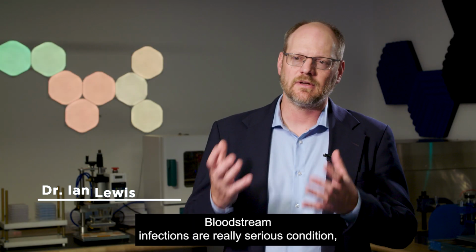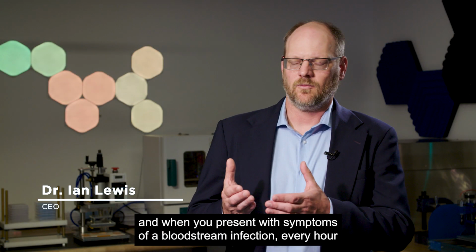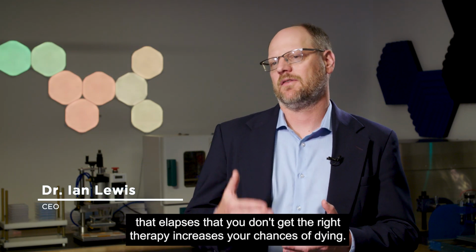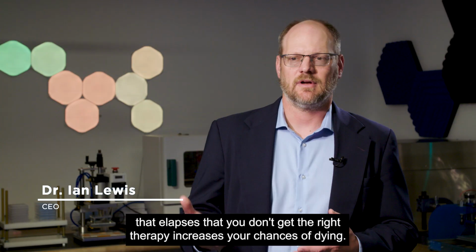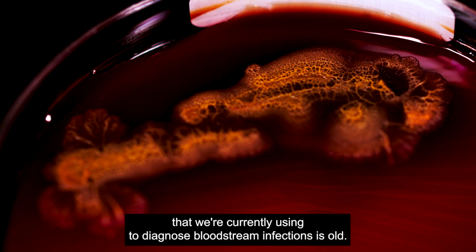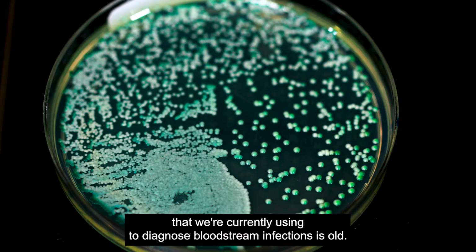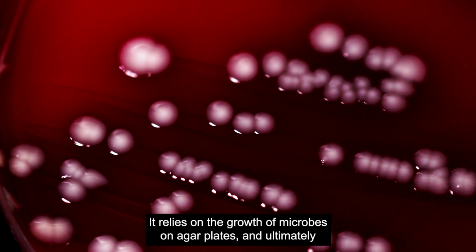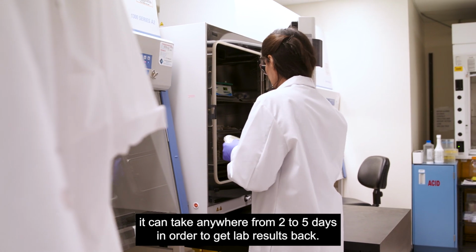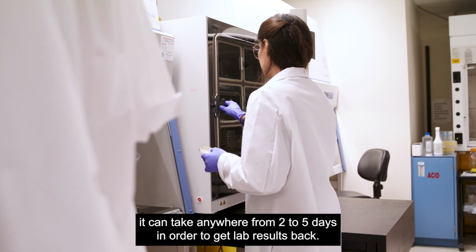Bloodstream infections are a really serious condition, and when you present with symptoms of a bloodstream infection, every hour that elapses that you don't get the right therapy increases your chances of dying. The technology that we're currently using to diagnose bloodstream infections is old. It relies on the growth of microbes on agar plates, and ultimately it can take anywhere from 2 to 5 days in order to get lab results back.